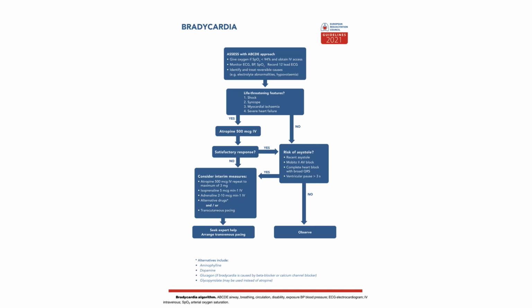When you do transcutaneous pacing, you also have to sedate the patient, or at least manage their pain, and always try to go as low as possible in the frequency, like they only need to be at 60, right? If you have a higher frequency, then you stun them more, and that hurts. And also you go for the lowest milliamperes to get mechanical capture.